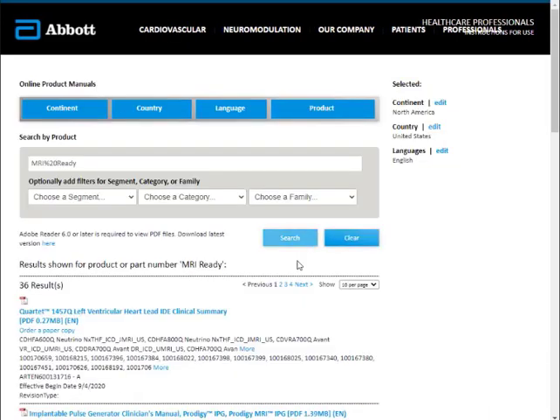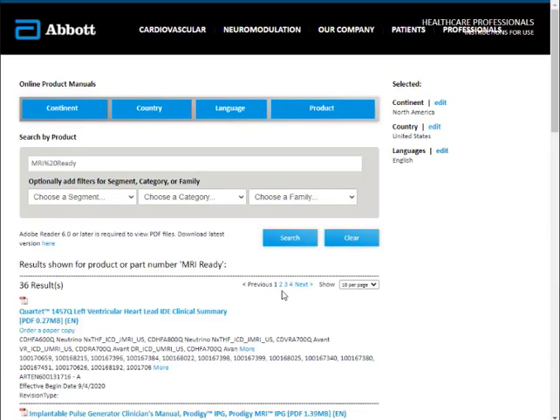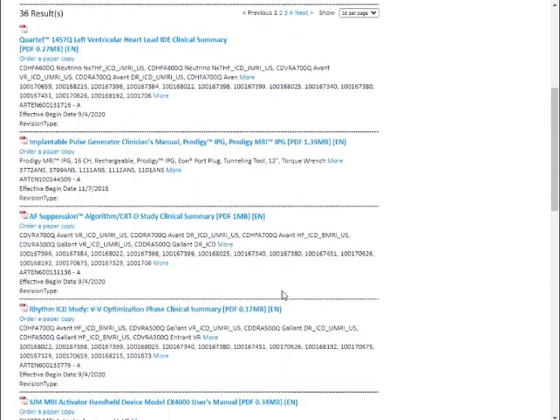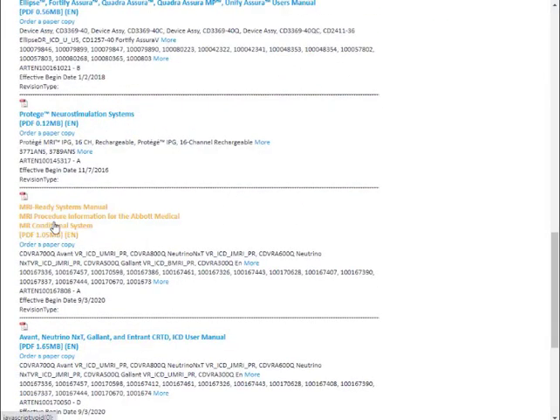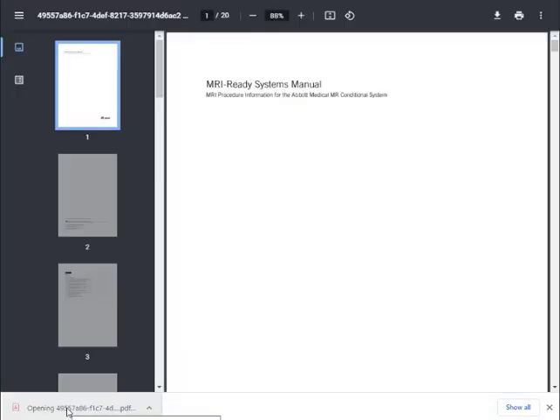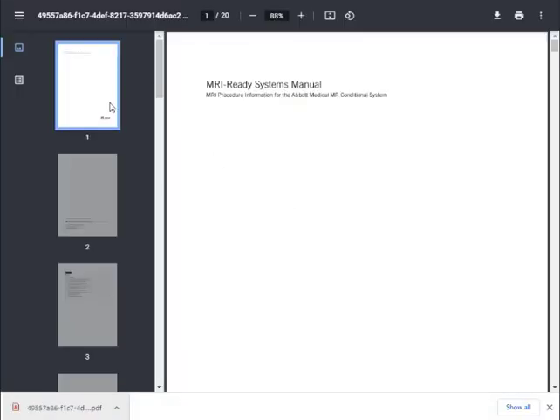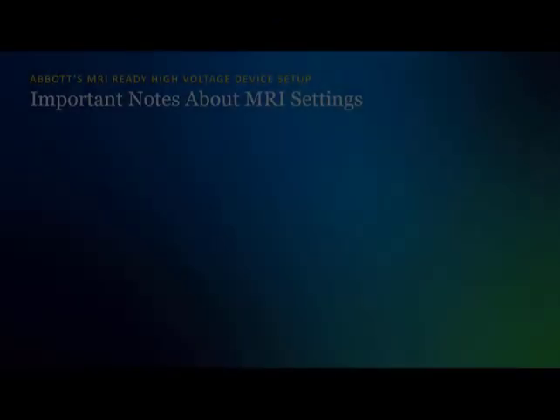Type MRI Ready in the Search by Product field and select Search. Alternatively, type in the model number of the product you are interrogating and select Search. Select the MRI Ready Systems Manual from the search results and download it for details on MR conditional models, device and lead configurations, and lead links, as well as more procedural information.